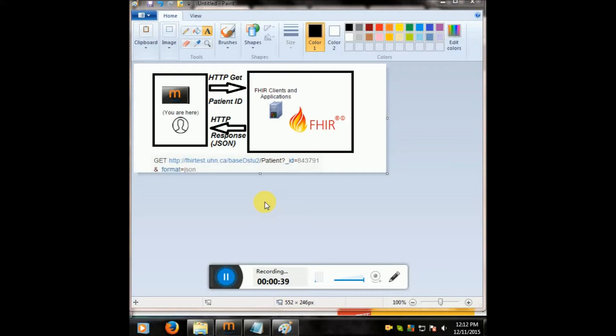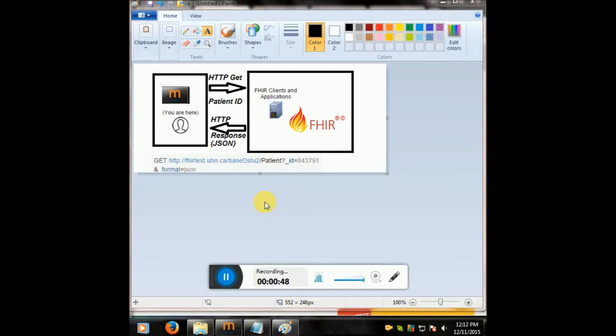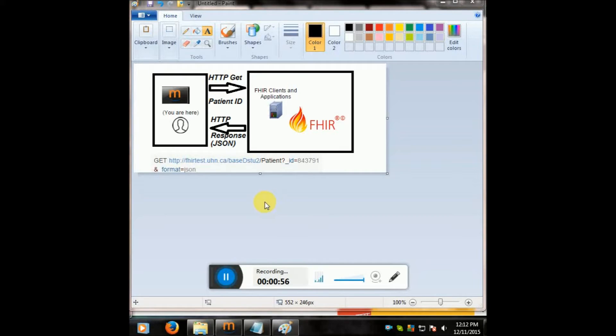So this is an intro to FHIR with Mirth and a FHIR server that I found online. All of these resources are free. I'm all about free, I love free and open source. So let's just start now.